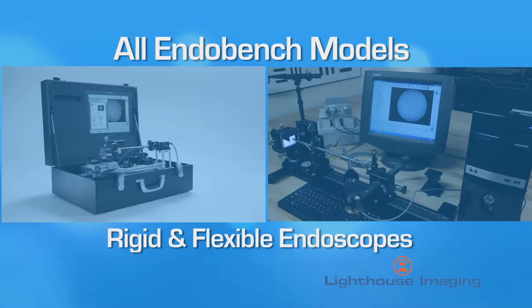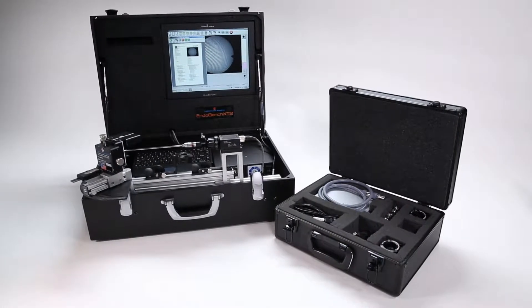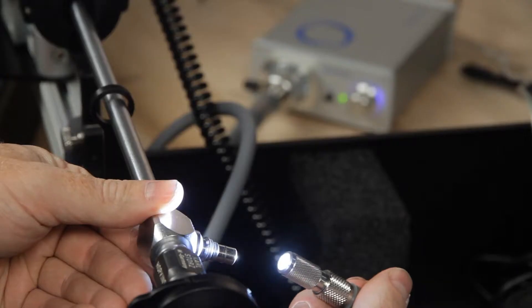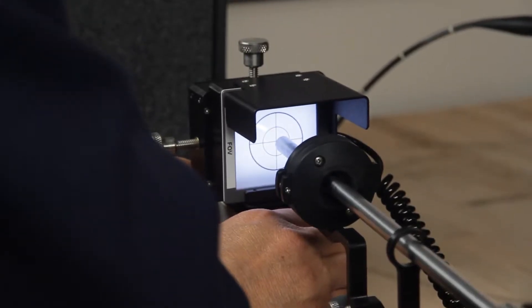All EndoBench models can measure both rigid and flexible endoscopes. One of the key features of the EndoBench XT2 and XTB is the ability to measure the illumination of the endoscope. We measure the distribution and location of the light because no matter how good your optics are, if your light's not shining where you're looking, you're not going to see anything.